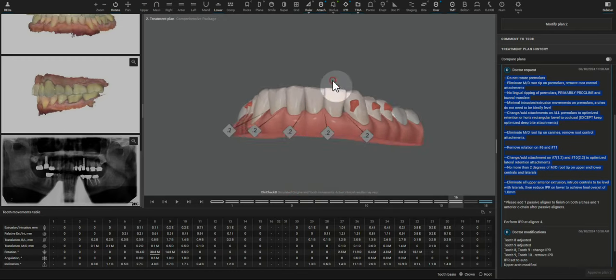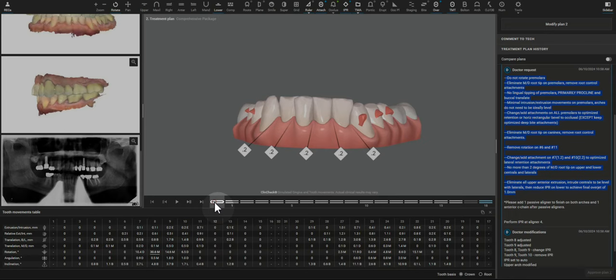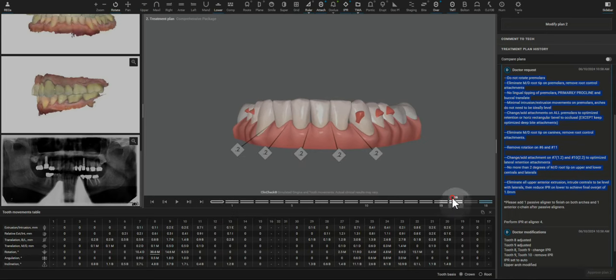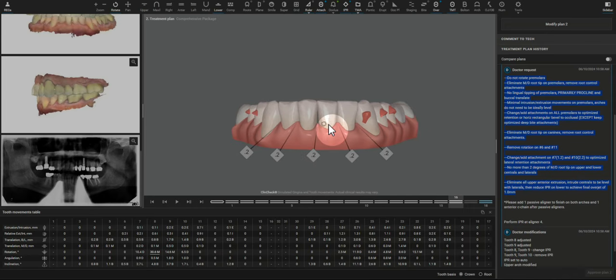But when we look at it this way in the help of the tooth movements table, we can see that there is almost a millimeter of extrusion. The rotation attachment does not do extrusion very well. Also, intrusion does not happen 100% clinically as what we see on the ClinCheck.